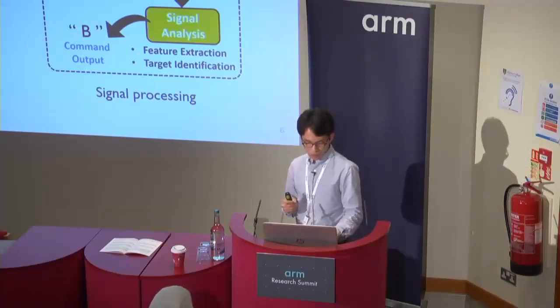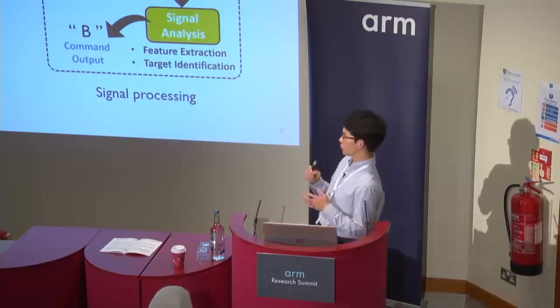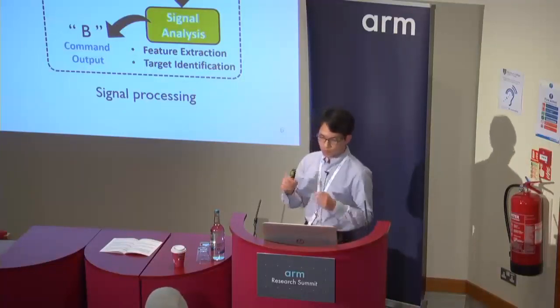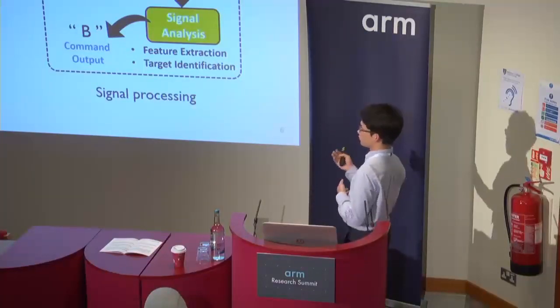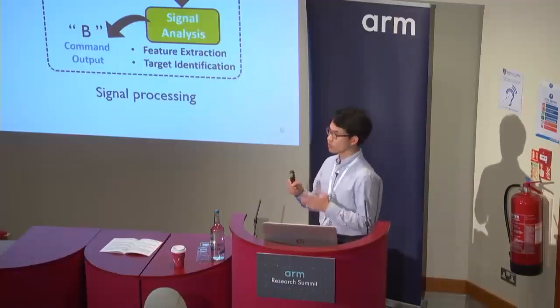If the visual target flickers at a specific frequency, in this case we call this brain response the steady-state visual evoked potential. This response contains the frequency information of the visual target. Then the BCI system will perform signal processing algorithms and reveal what target the person is now looking at.